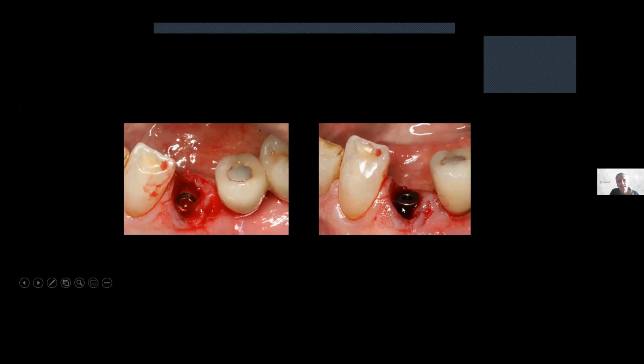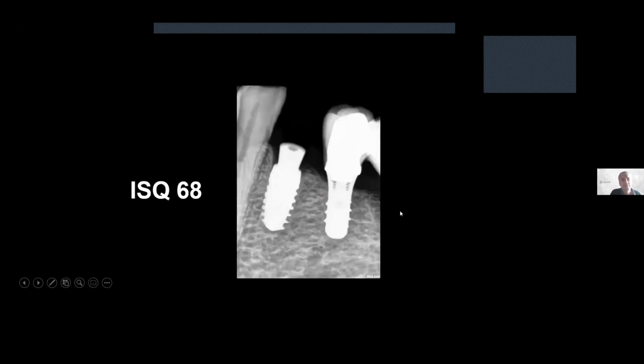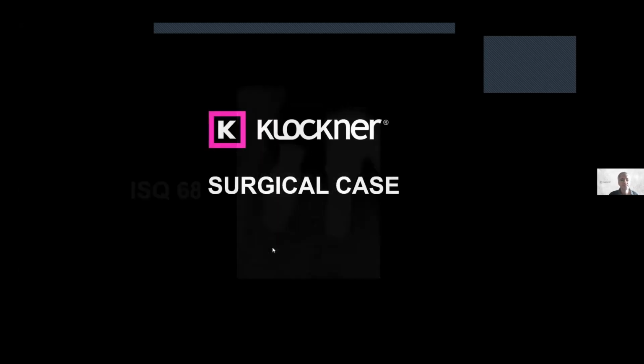And we don't even press the soft tissue to get inside, like we did before, because Tarnow said that there's no need to; we have to stabilize the coagulum. We can just place some collagen sponges here, and then let it heal. We get an ISQ of 68, just under drilling 2 steps, okay? 3 millimeters here, about 1.5 or 2 millimeters subcrestal.